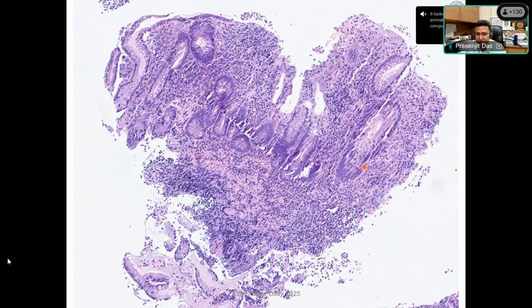I am specifically asking you if there are eosinophilia and basal plasmacytosis, because now it is chronic active, there is ulceration also. Okay, chronic active colitis, we need to differentiate between an IBD and non-IBD. Eosinophilia, yes or no? Look at the color of the cells. What do you think? Reddish brick color cells. Can you see here? Lot of them. Yes, sir. Okay. Some eosinophils have been increased.